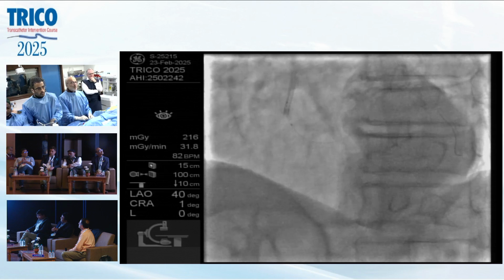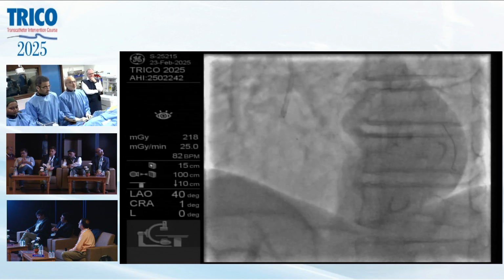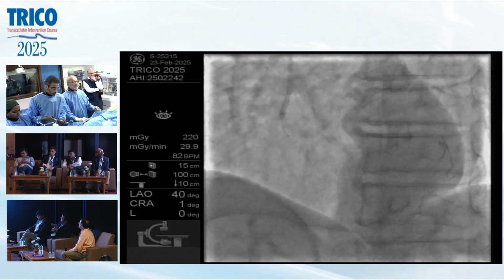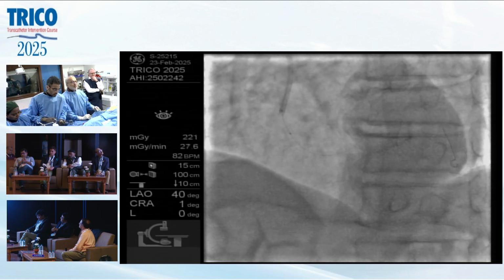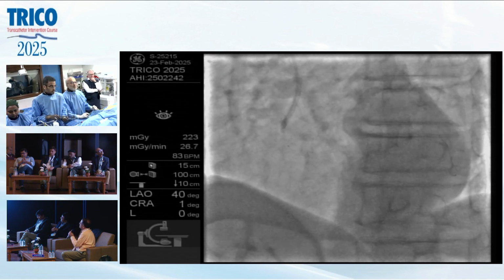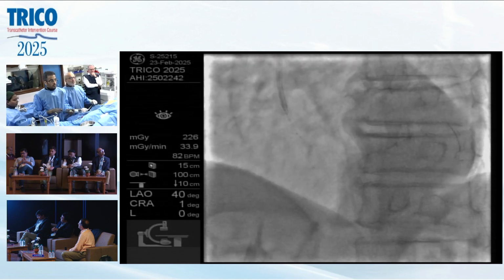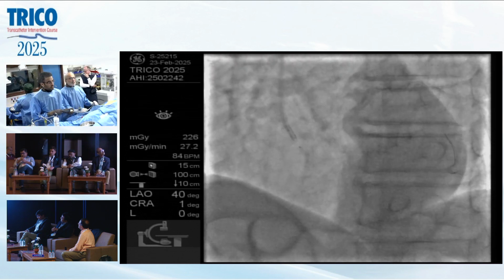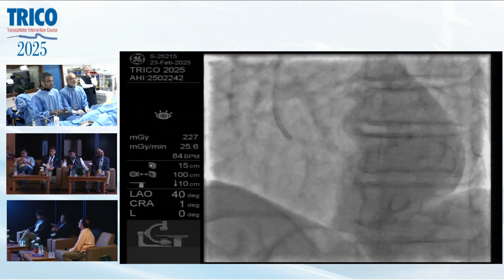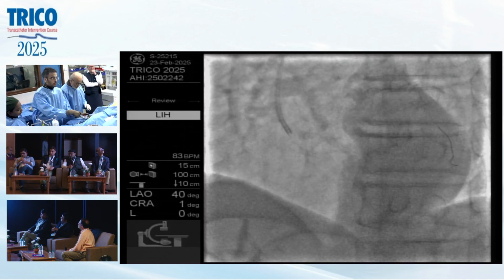Okay. Now go at 3 atmosphere. Go at 3 atmosphere. 3, it's a 2 millimeter balloon. 2 millimeter. And deflate it now. Okay. Just pull it back. And now we see it is perfectly well aligned, I suppose.